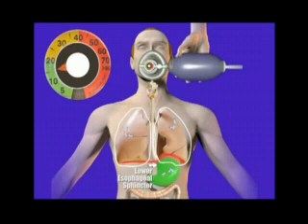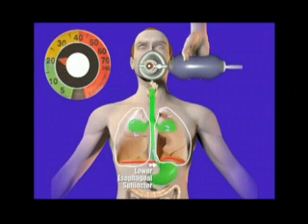As the stomach inflates, pressure increases in the chest cavity and constricts the heart. This increased intrathoracic pressure reduces venous return and inhibits the heart's ability to fill with blood. The result is poor cardiac output and reduced blood volume delivery to the vital organs. In addition to increasing intrathoracic pressures, the stomach continues to inflate to the point that vomiting is imminent.